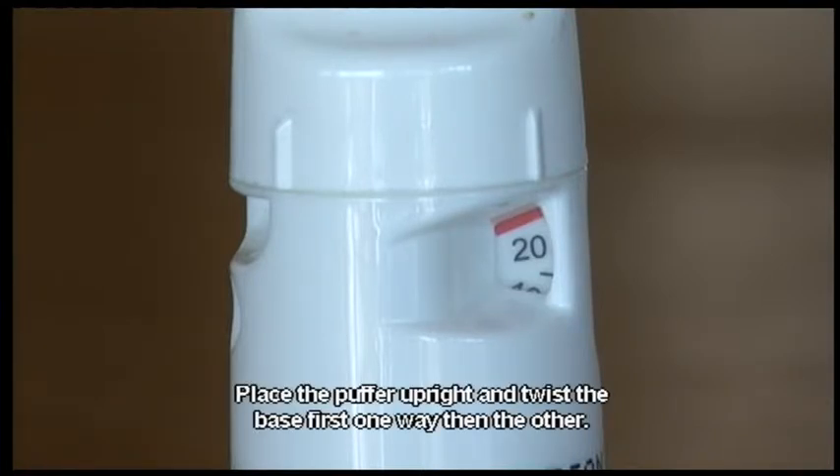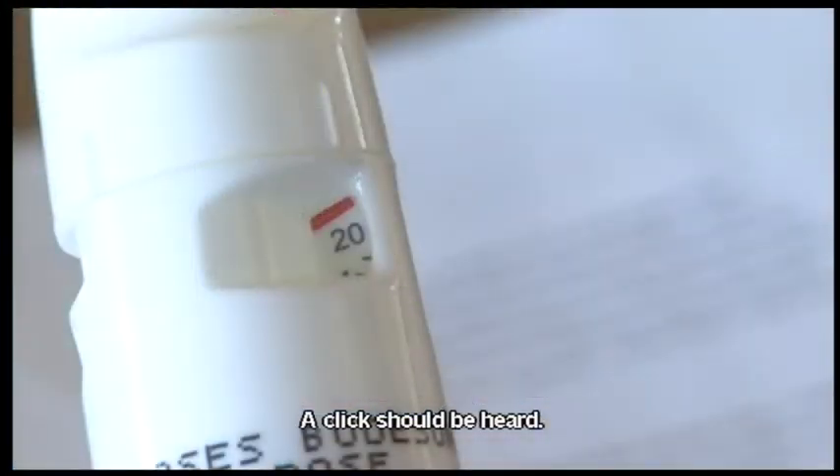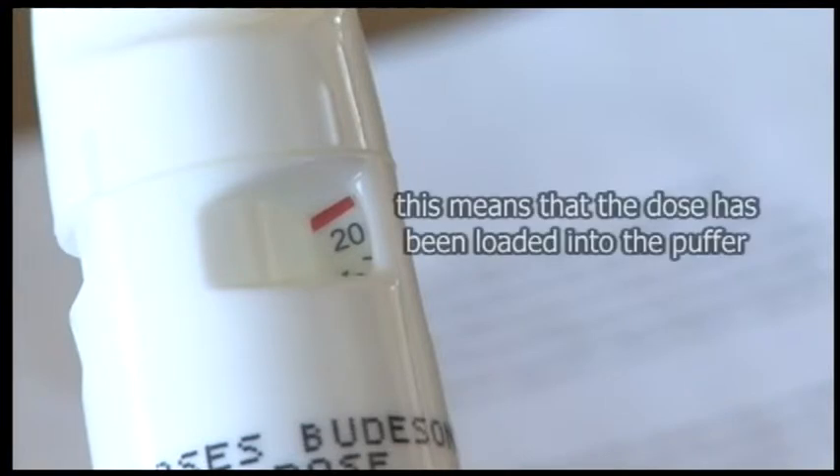Place the puffer upright and twist the base first one way, then the other. A click should be heard. This means that the dose has been loaded into the puffer.